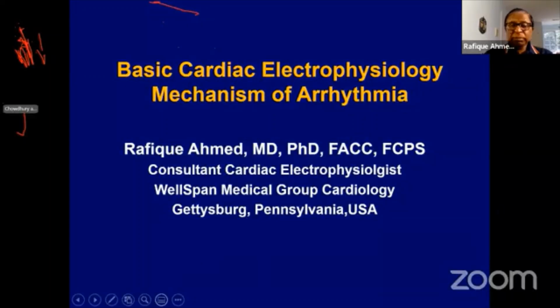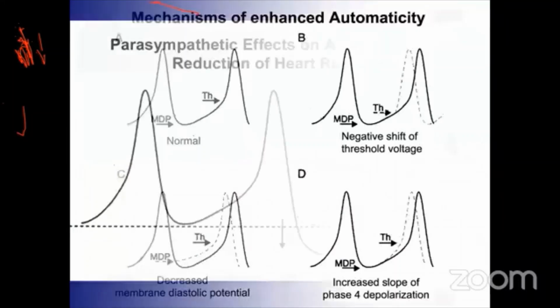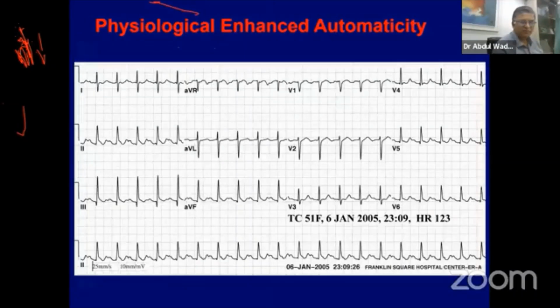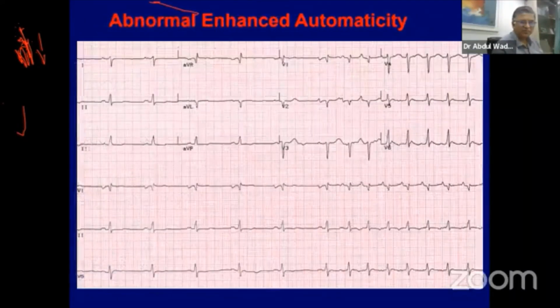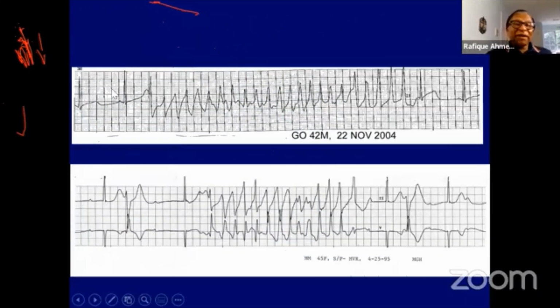look at this one. What happens if you look at this QT interval? I don't have the previous R wave. There is a little bradycardia, and this QT is longer. And this is actually triggering the torsade. That's why in torsade management, if we can get the heart rate up, look at this example.